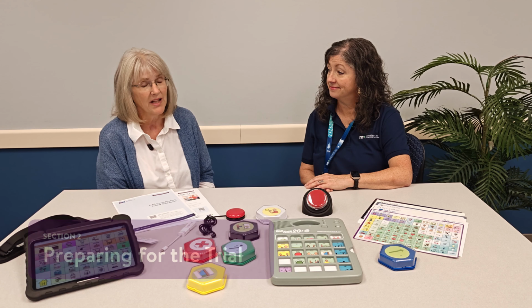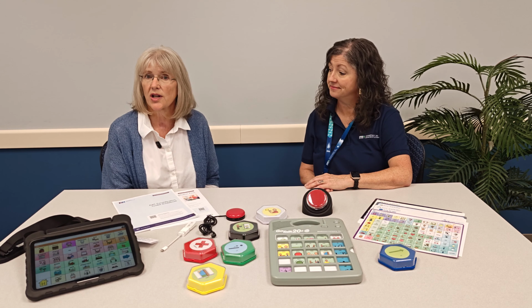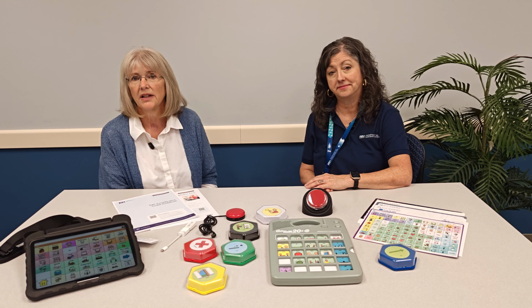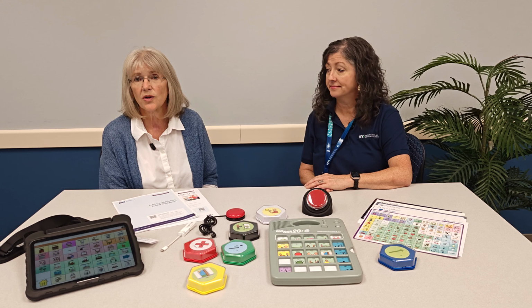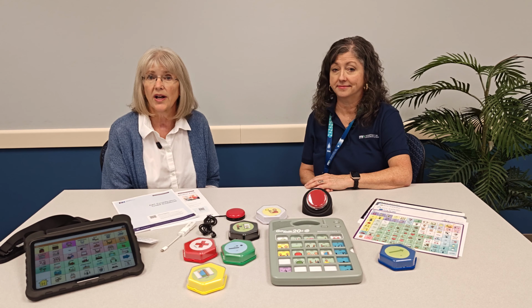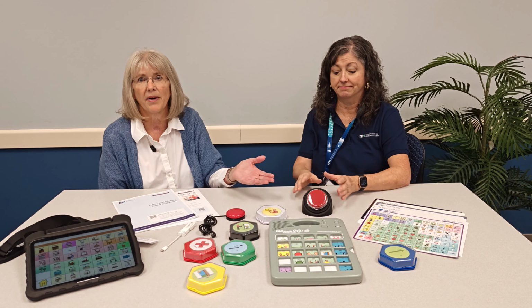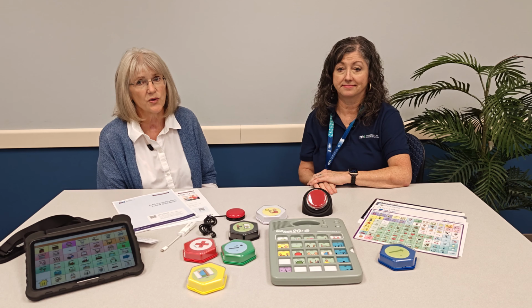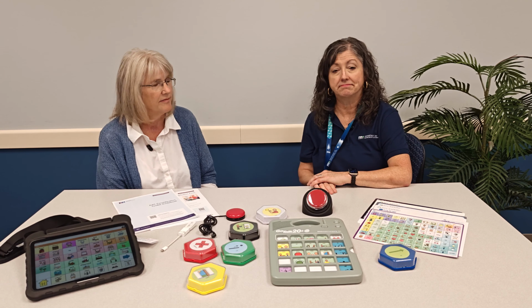interests and skills. It begins with guidance for emergent communicators, students who are just learning the power of communication. You'll find strategies for introducing symbols using tools like talking tiles or step-by-step devices, as well as creating opportunities for the student to assign meaning to their communication.